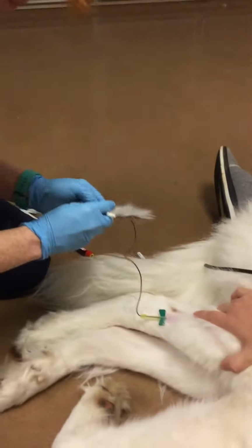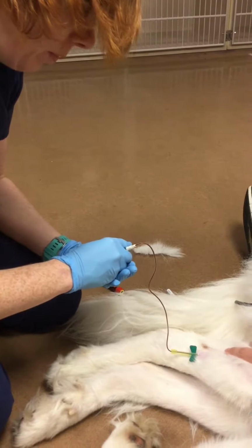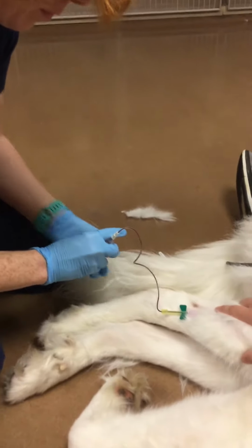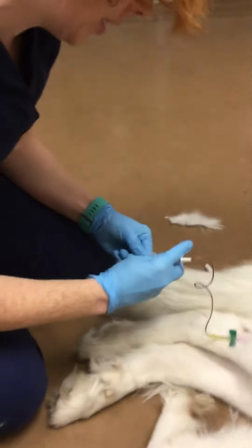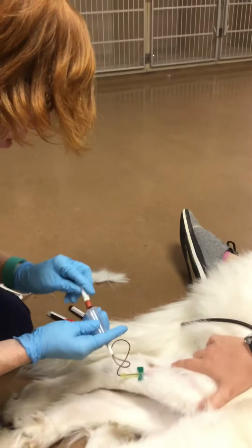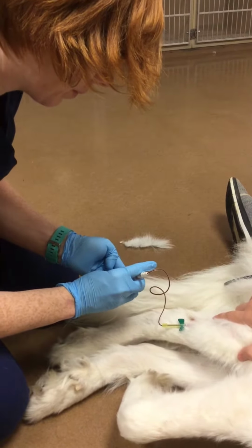So I have one serum here. And then there's 2 ml here of the EDTA. And the last bit of serum for the red top.